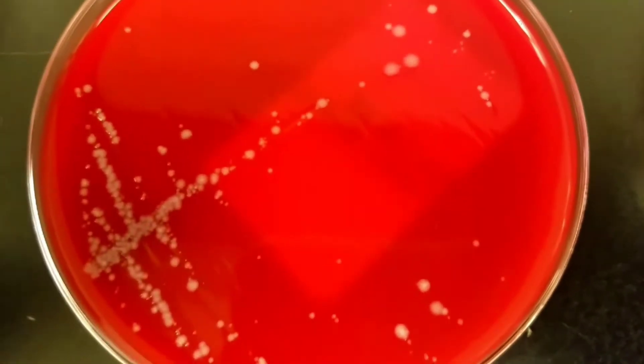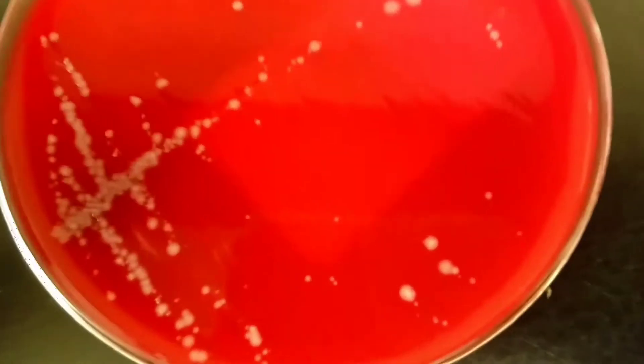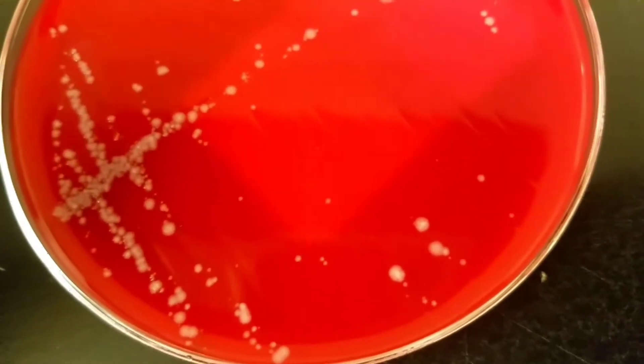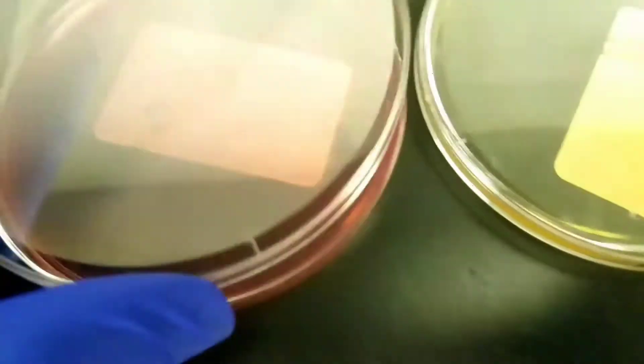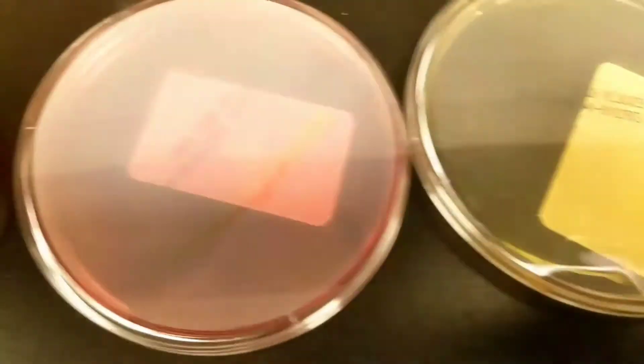It looks like maybe two different colony types — we have the big circle, the big white, and then we have some of the little speckled dots. But on the MacConkey there is no growth, and there's no growth on the BEA either.